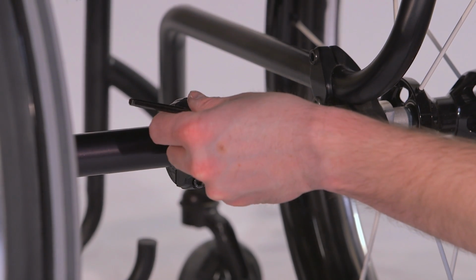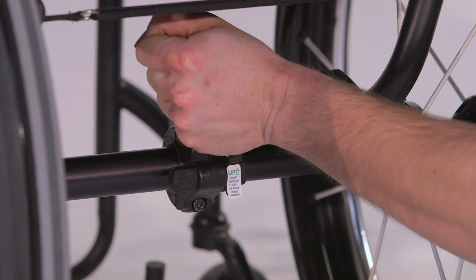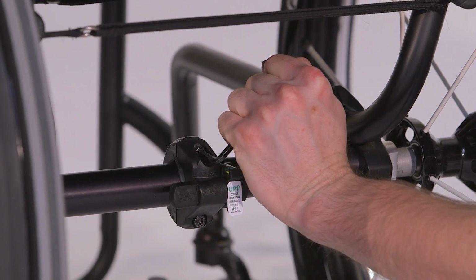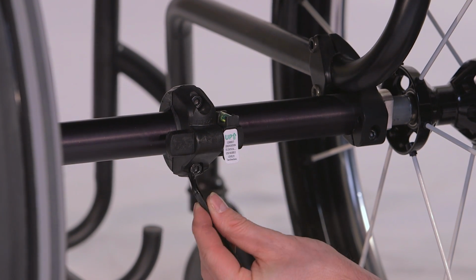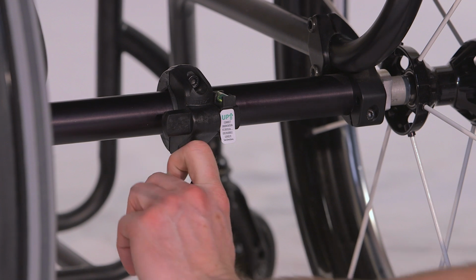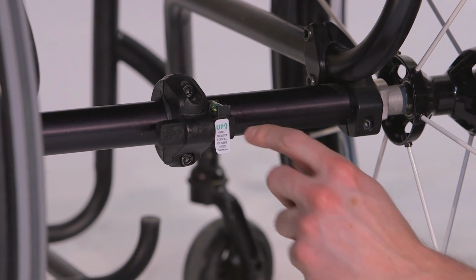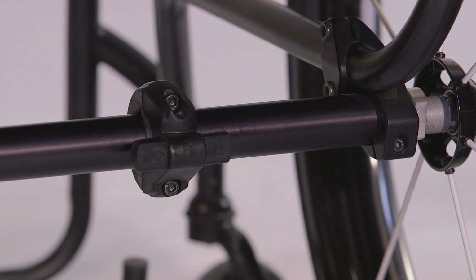Once the orientation is correct, really crank down on both screws to make sure that it is fixed on the axle and it won't move over time. One final check at the bubble level for correct orientation, and then you can take it off.